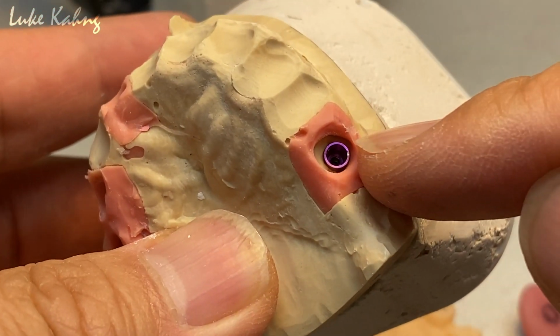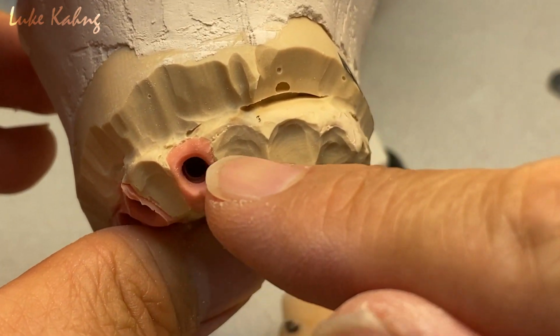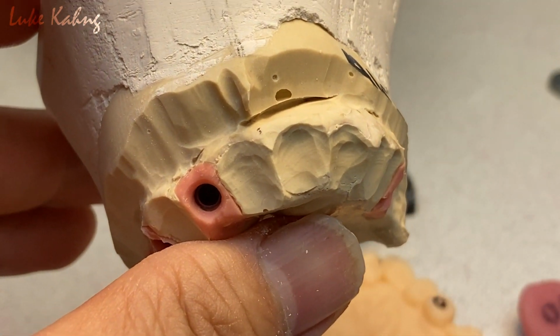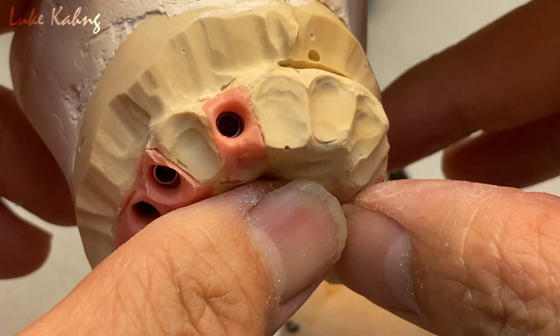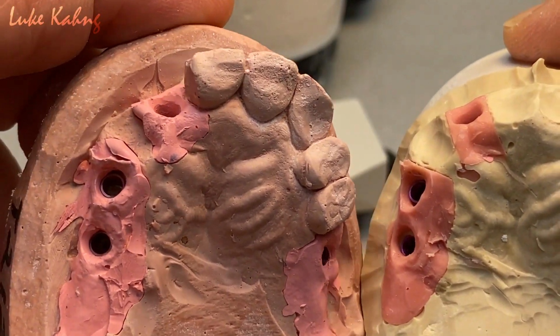You see it's a rectangular shape. You saw it previously. And most I like the matching of the aesthetic design from the pink. Aesthetics. I'm trying to grind a little bit more here. Okay. And then make a better contour compared to before. Now here's the before and after.